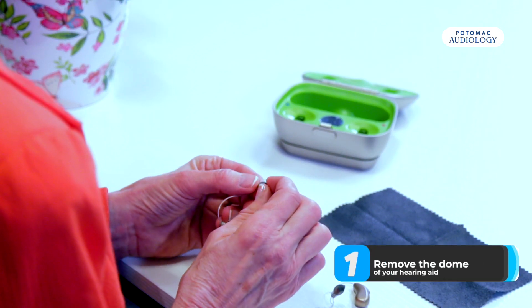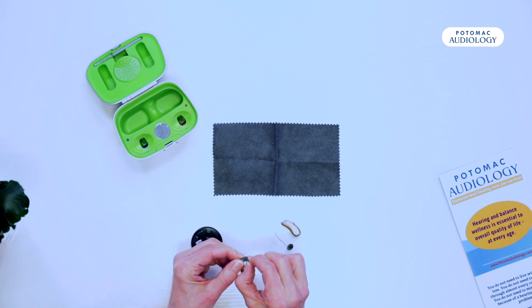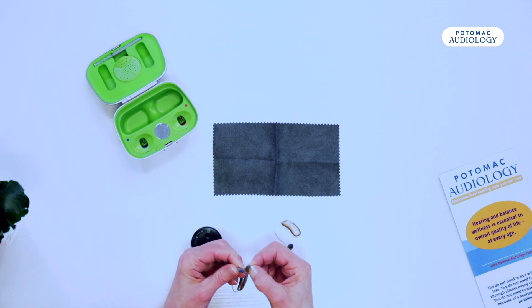You can actually remove this dome by taking your fingernail and pulling it up and over the end.